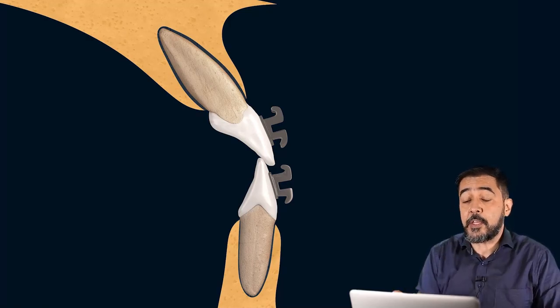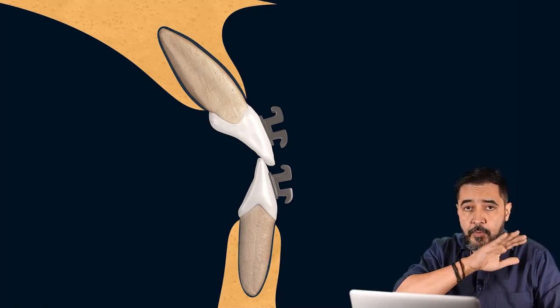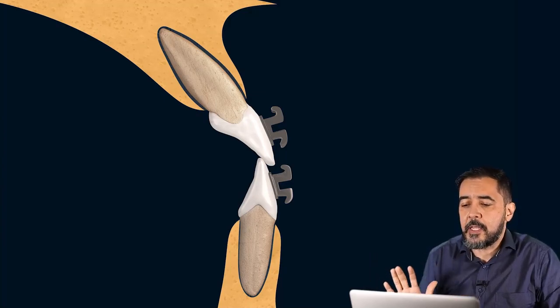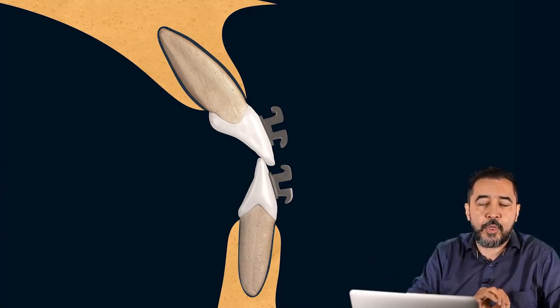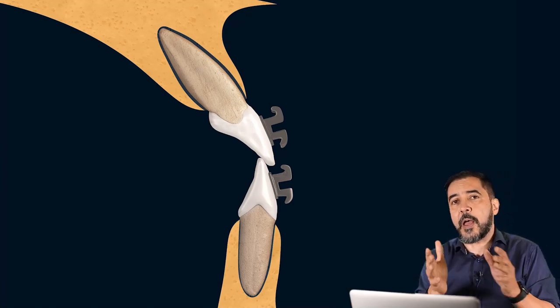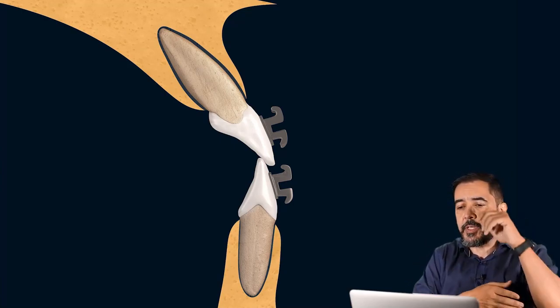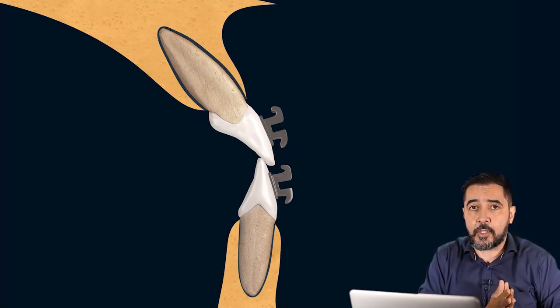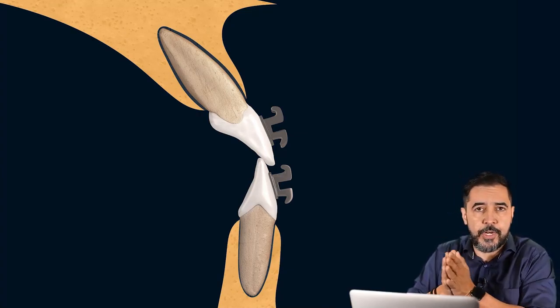Everything you did until now is completely okay. It's right, it's what was meant to be done. But now you are using a different concept here. We're using the concept of generating a couple inside the slot, because you know that round wires don't generate couples.